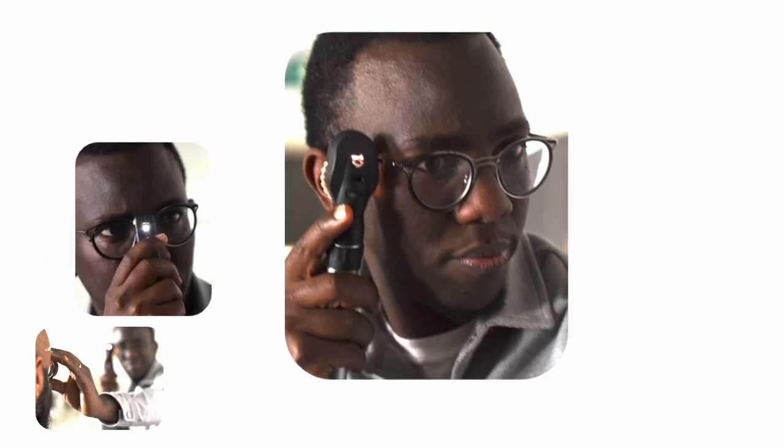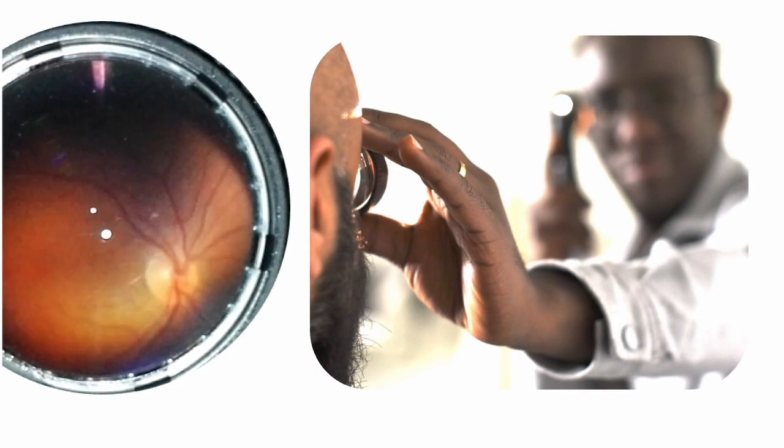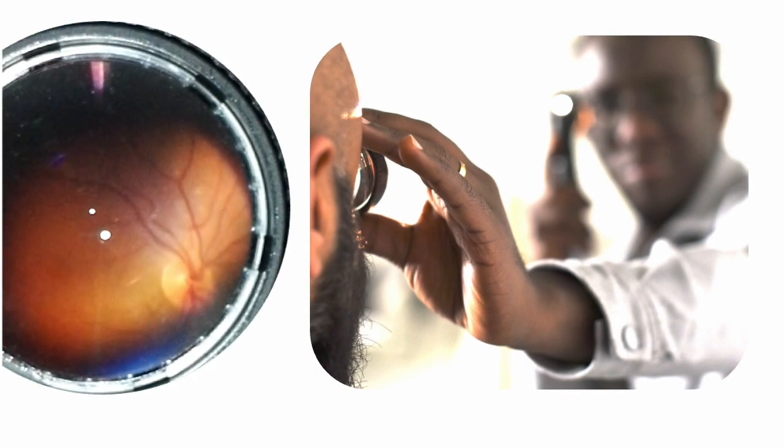Indirect ophthalmoscopy can also be performed using the light source of a direct ophthalmoscope. Placing it by the side of the eye allows a monocular view, and between the eyes a binocular indirect view. This is most effective through a dilated pupil, and presbyopic examiners will need to wear near correction.